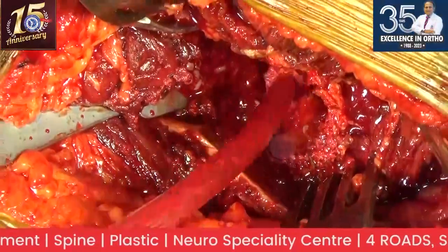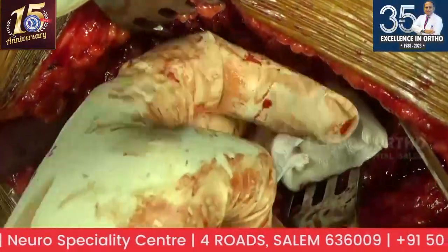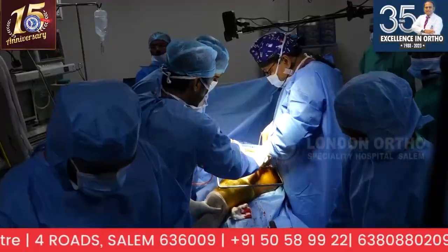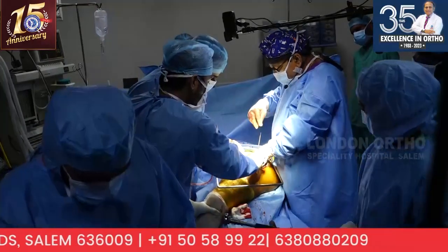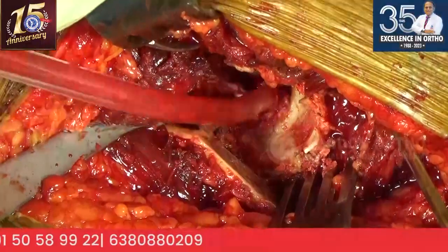In a very sclerotic bone like this, and particularly as we get blunt reamers sometimes, I make multiple drill holes so that the reamer bites. I'm a bit worried about the medial.